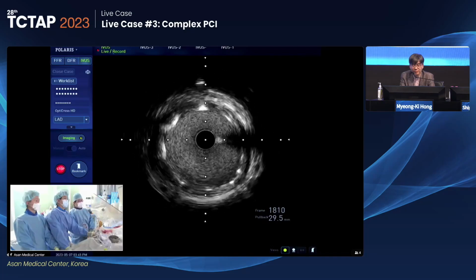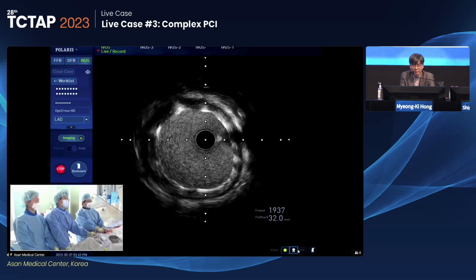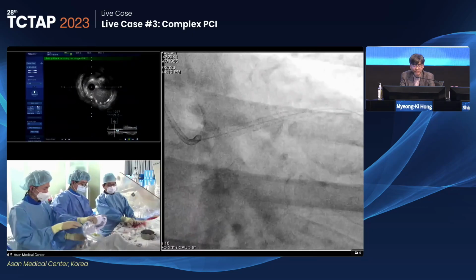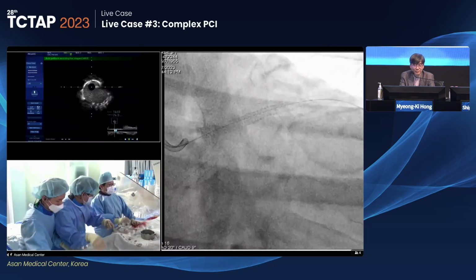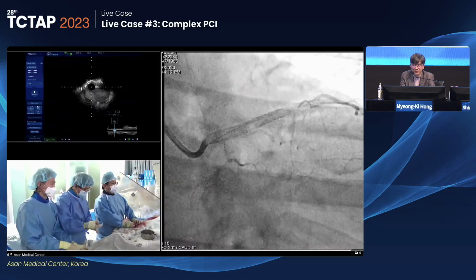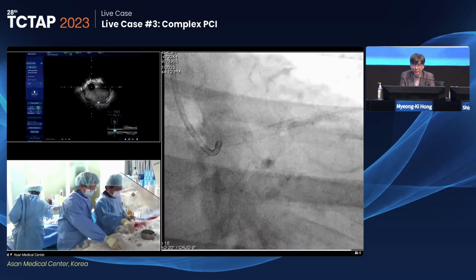I believe his chance of restenosis would be excellent, less than 1%, I believe. Test, please. Nitro. Well, it's probably more than 1%. It already restenosed the first time.